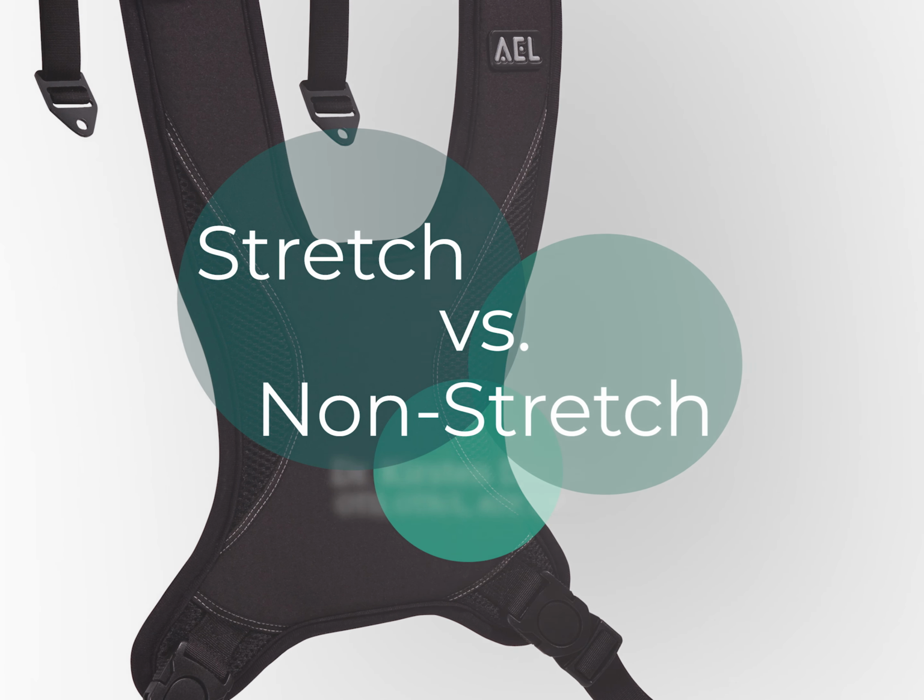Prior to implementing any sort of anterior support, as noted in other tutorials, it's important to address the position of the pelvis. The evaluating individual should confirm that the pelvis is in as neutral a position as possible, trying to eliminate or reduce any posterior pelvic tilt, where the top of the pelvis is tilted posteriorly, causing forward flexion and a kyphotic presentation, and also trying to reduce or eliminate anterior pelvic tilt, where the top of the pelvis is tilted towards the front of the seating system.